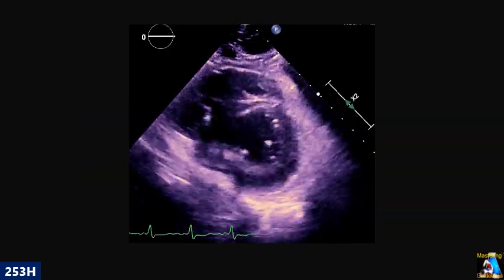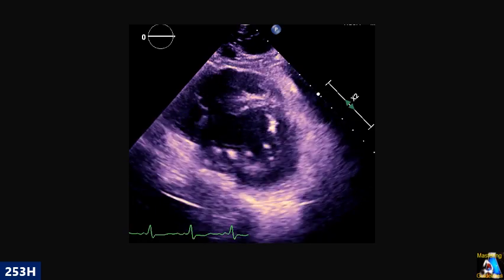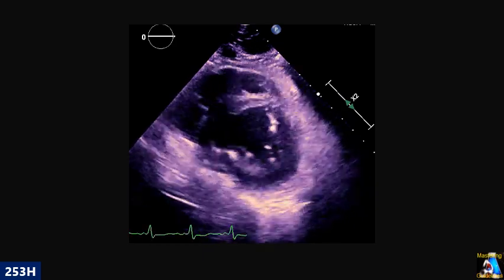Here is another patient. You are doing PSAX. You see this one. Is that correct PSAX or not? If yes, what abnormal finding can you see and what does the patient have? If it's not correct, why, and how do you fix it?